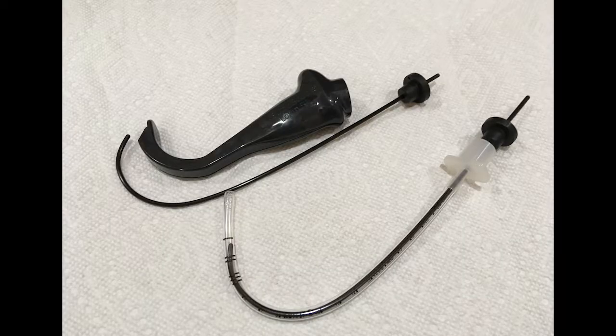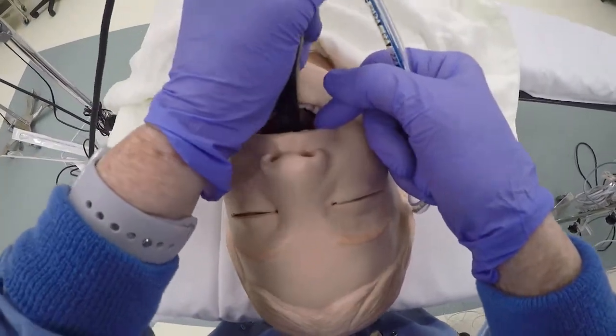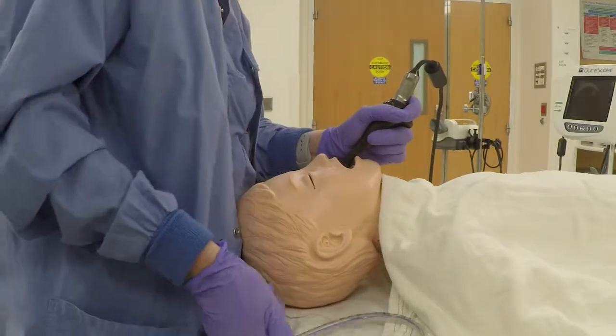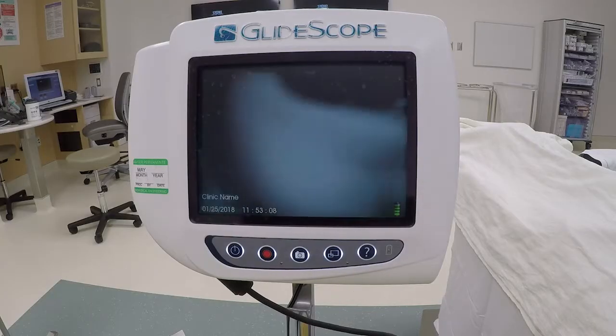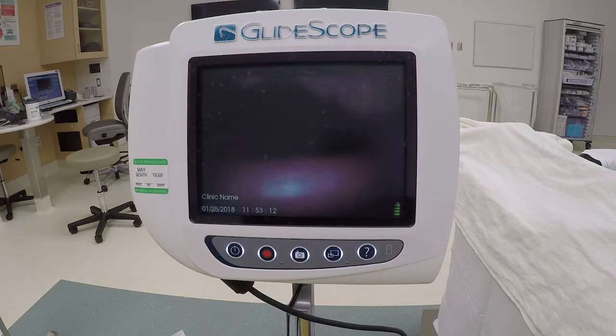The technique is the same as for an adult. To prepare the tube, insert a semi-rigid stylet into your endotracheal tube and match the shape to the shape of your blade. Insert the blade midline, looking at the patient. Don't sweep the tongue. Don't insert the blade too deep. Once the tip of the blade turns the corner, look at the monitor to optimize position.